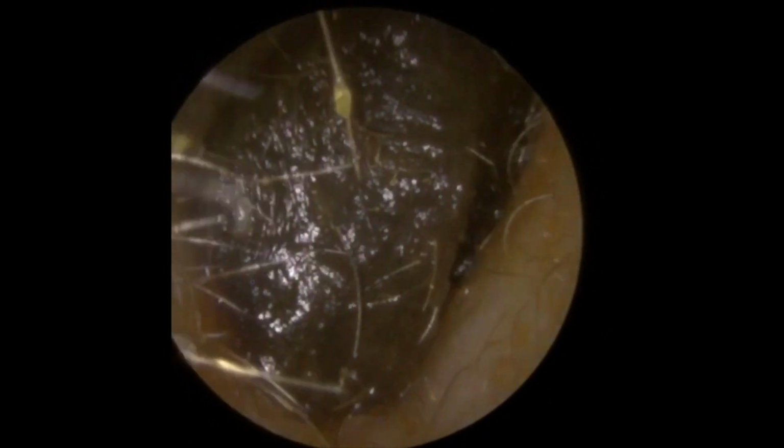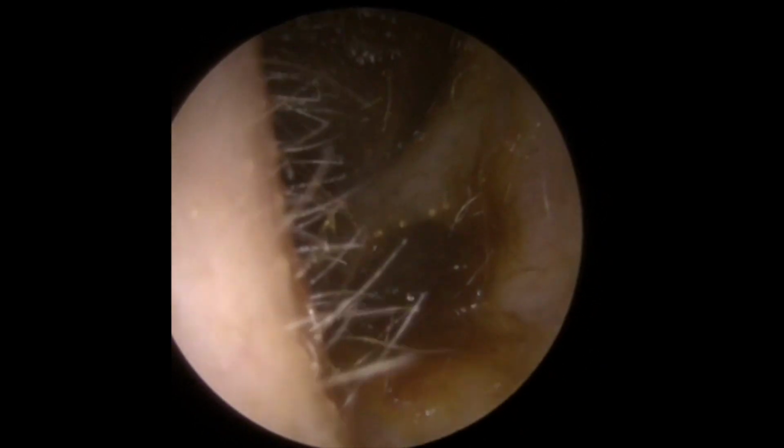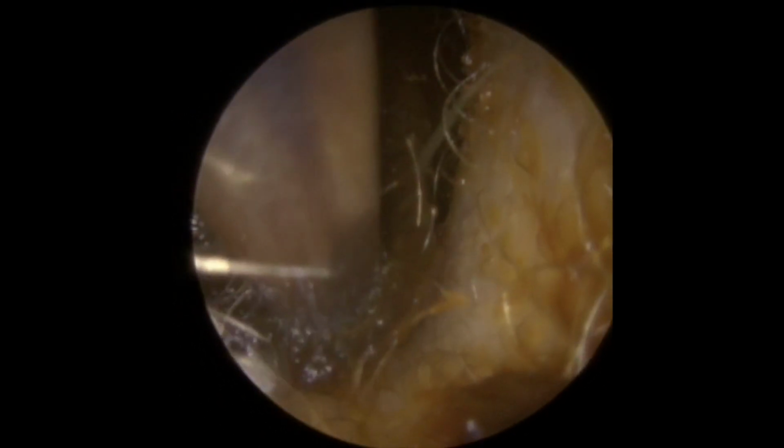So this is our second patient in the compilation. This patient's come through with reduced hearing on one side. What you can see here is a very sticky type of wax. So we're going to use the suction tube first of all, because sometimes even with sticky wax it will stay together quite nicely, so we can sometimes take the whole thing out in one chunk. So we're just going to grip on it with the suction tube.